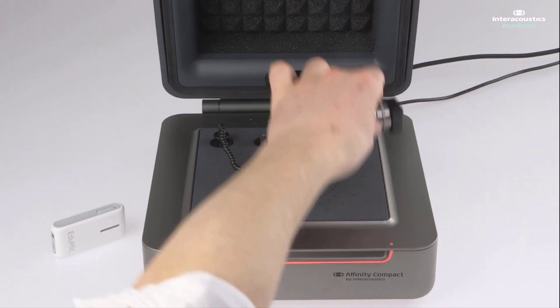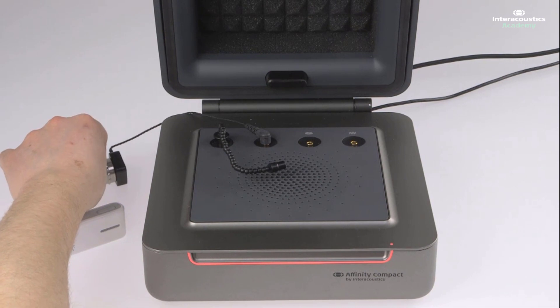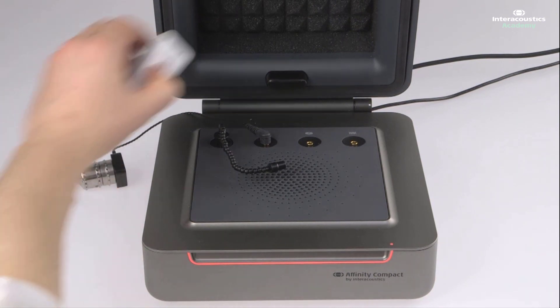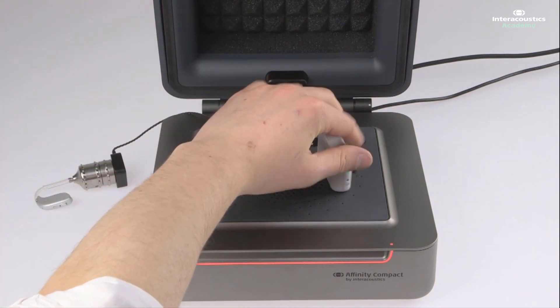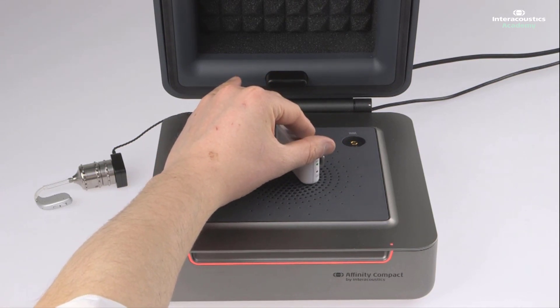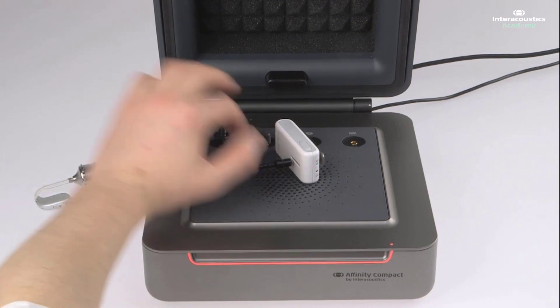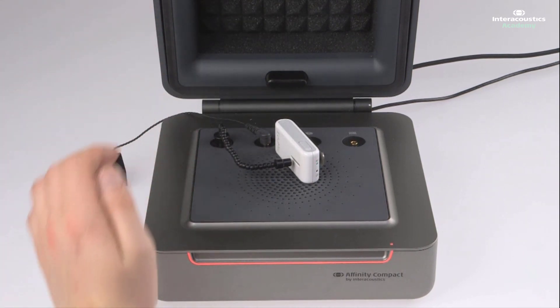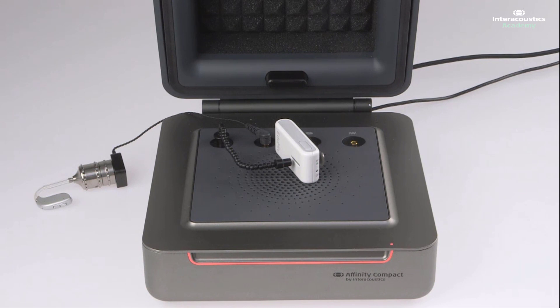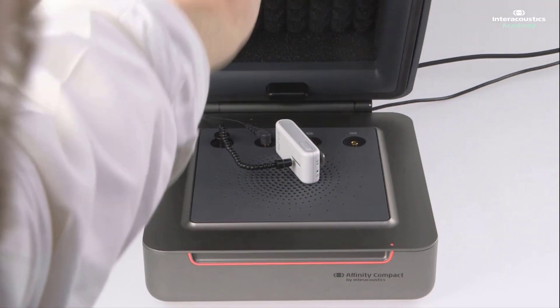The final step is to take the hearing aid outside of the test box, and in its place, put the FM microphone inside. Here you want to align the microphone of the FM system with the reference microphone of the test box, the same way as you would with the hearing aid. Once everything is in position, the test box lid can be closed, and we can enter the software in order to measure the response.